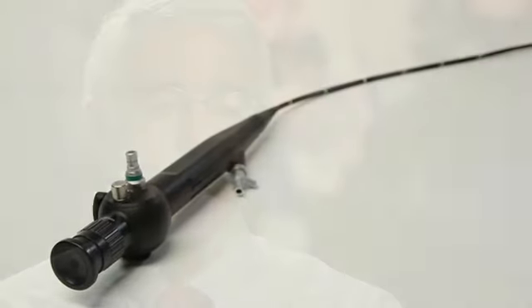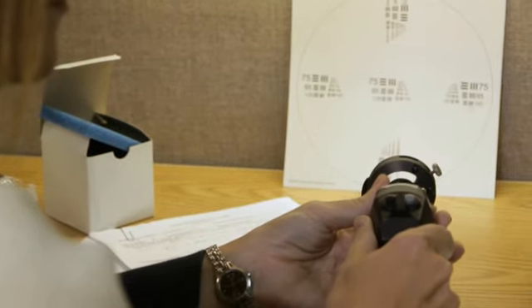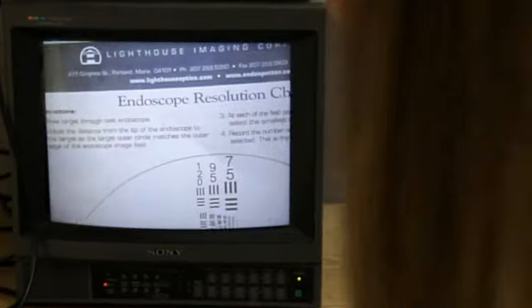However, what we found was that a measurement made in the morning by an operator may look acceptable, but the same operator looking at that same scope later in the afternoon with tired eyes would draw a completely different conclusion.